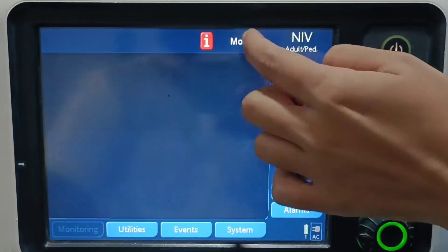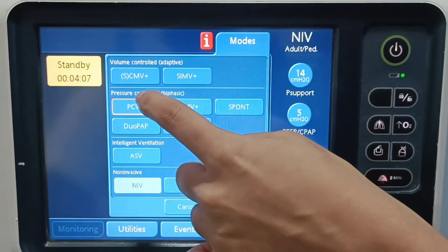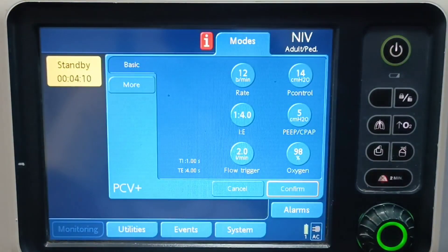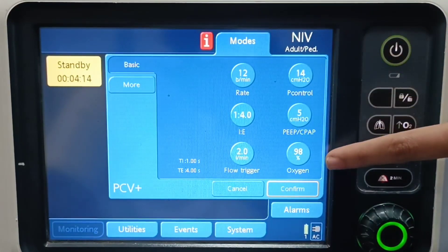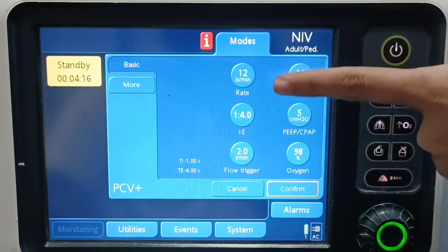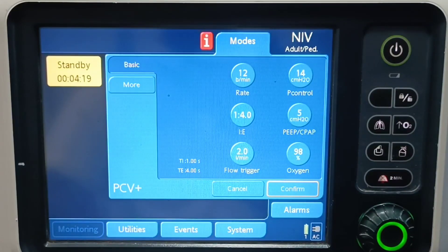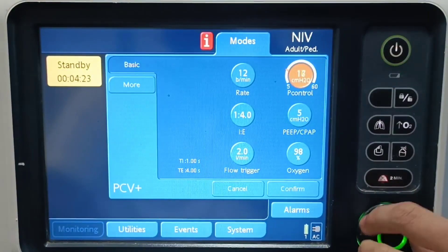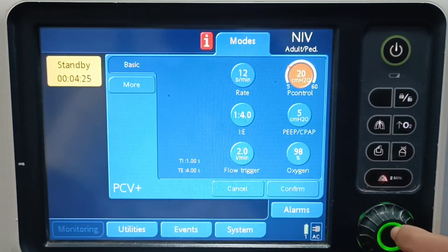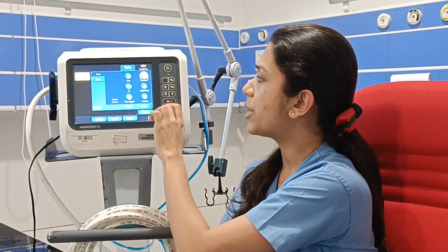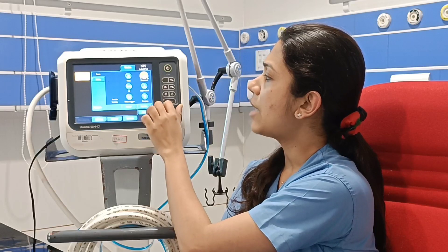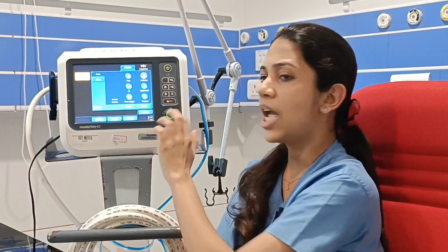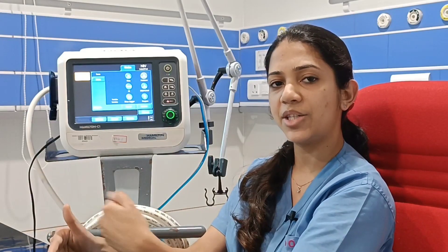When opting for PCV mode, we have to set the pressure control, the PEEP, the FIO2, the respiratory rate, the I:E ratio, and the flow trigger. For pressure control, we usually keep it around 15 or so. We can reduce or increase the pressure according to our need, depending on patient condition and the next ABG.